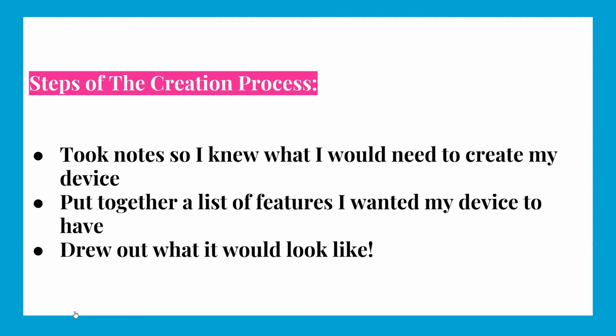And then the very last step of my creation process, which was probably the easiest and most fun, was that I went through and drew what I wanted my device to look like. I was able to draw where I wanted different buttons to be, and I was able to just make it my own, which I thought was really exciting.